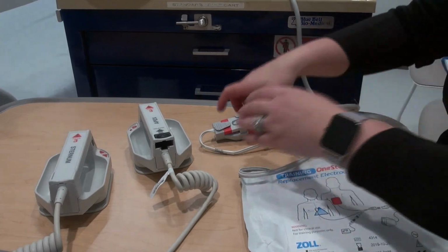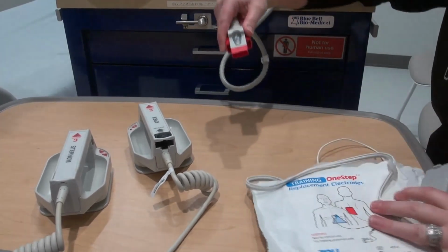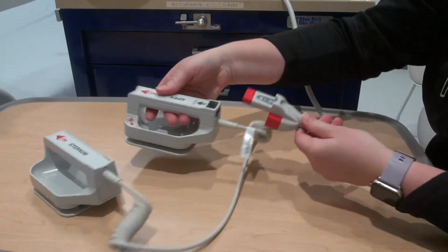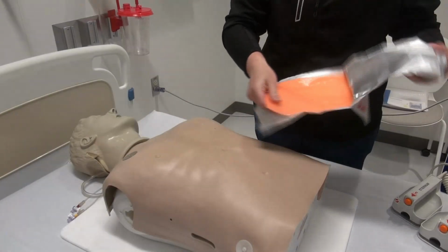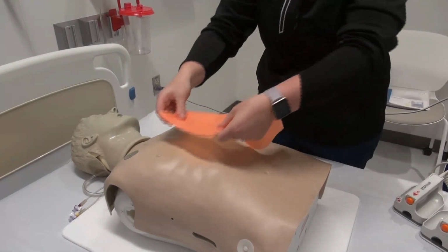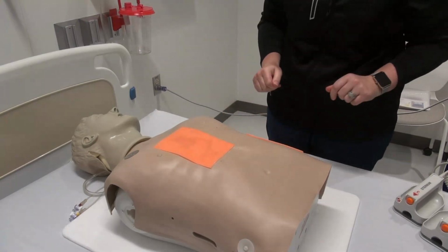Remove the one-step pads from the cable attaching them to the Zoll defibrillator by pressing down on the tab and pulling apart the connection. Insert the paddle connector to the cable with the arrow pictures facing one another. Place the gel pads according to the package directions. Correct placement of gel pads is one pad at the apex of the heart and one pad at the second intercostal space on the right sternal border.